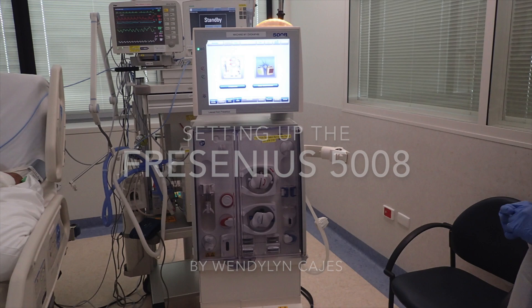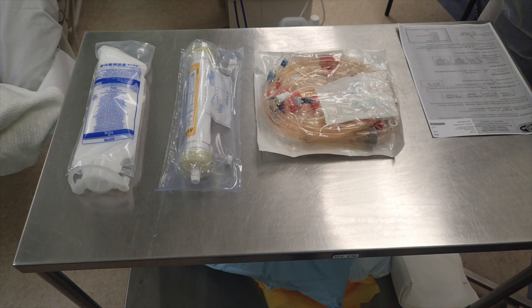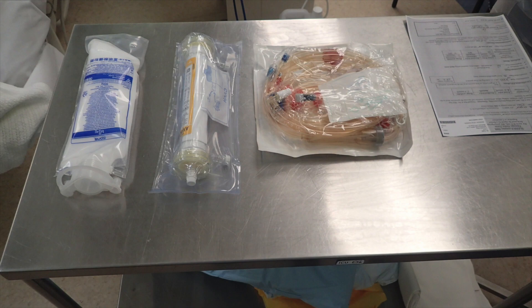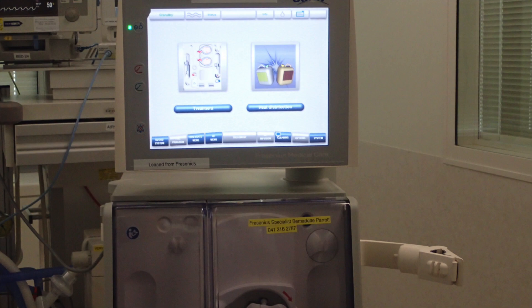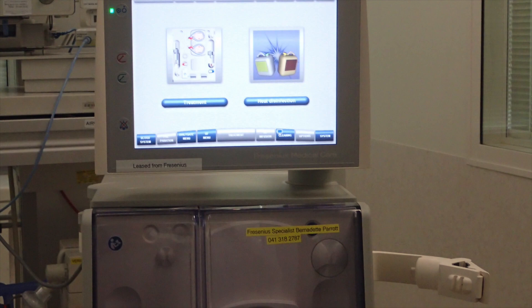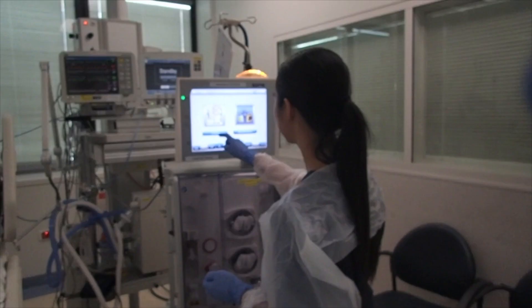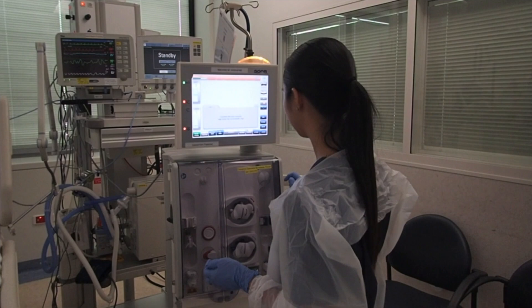Hi, today I'm going to show you how to set up the Fresenius 5008 hemodialysis machine. After testing the water for chlorine, you need to make sure you have all your equipment, which includes the Fresenius machine, Part A solution, AVset Online, AV600S filter, the bi-bag, your potassium modifier, and hemodialysis order. Make sure the dialysis machine has completed a disinfection cleaning process within the last 24 hours before using the machine. The following video will now show you how to set up the machine and link it to how a kidney works.